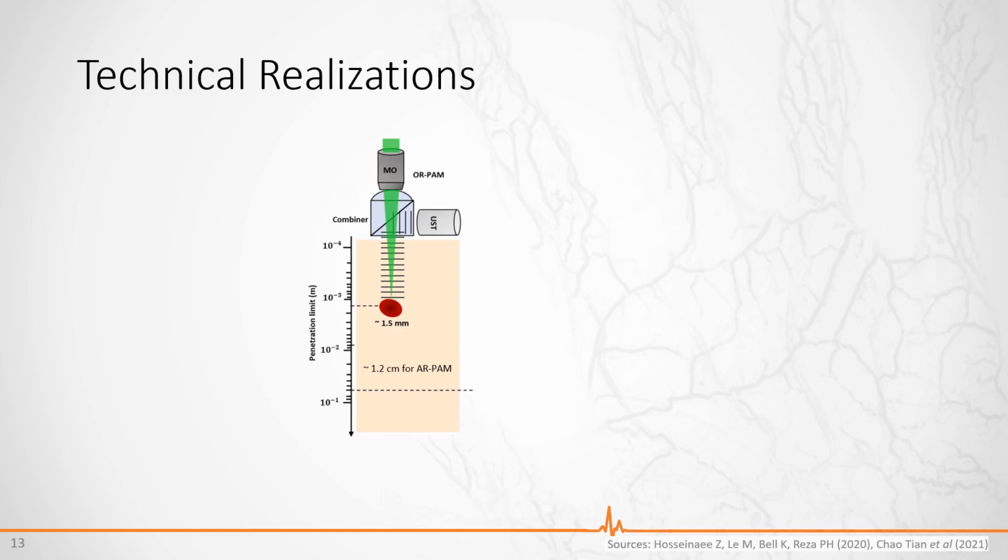The ultrasonic waves are more resistant to diffusion, therefore these devices can achieve deeper imaging depths, but they are harder to focus, which leads to a lower resolution. To create 2D images, then a sample is rastered.